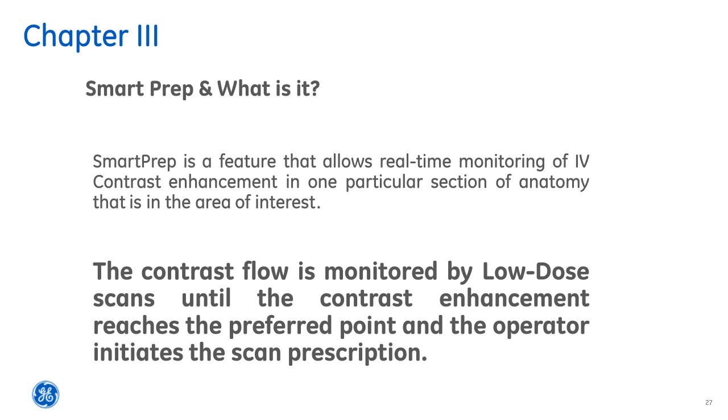So if we use the technique that we refer to as Smart Prep, it allows us to real-time monitor the IV contrast in the area of anatomy that we're specifically interested in. And when we see the contrast reach peak enhancement, we can then trigger the scan, because we know the scan is going to take place when the contrast is, we can see, at its optimum.